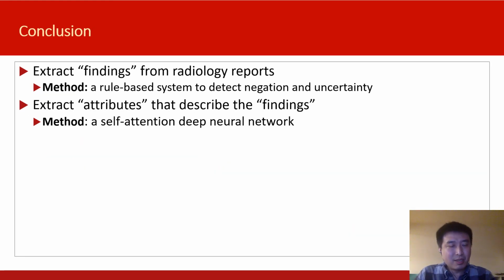To summarize this section, I demonstrated two use cases of using clinical natural language processing techniques and deep learning in assisting medical image analysis. In the first project, we use a rule-based system to extract diseases or findings from the radiology reports. And in the second project, I demonstrated how we can use a deep neural network to extract attributes that describe the findings in the radiology reports.